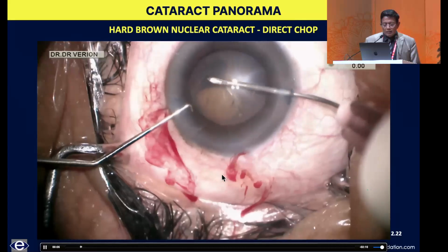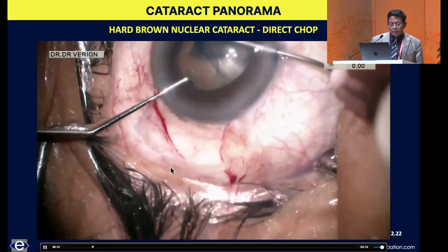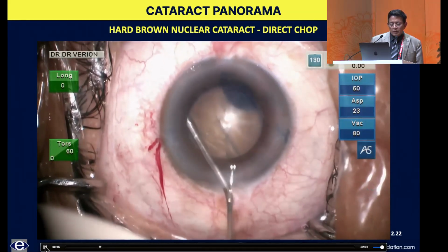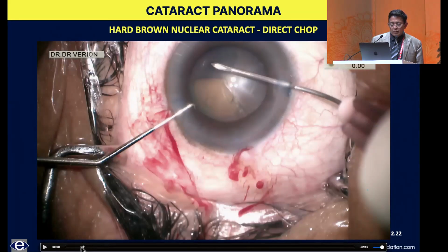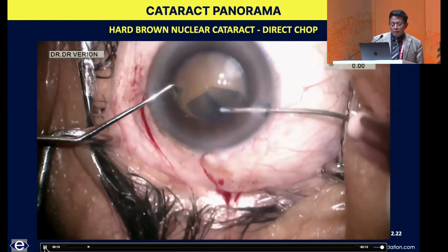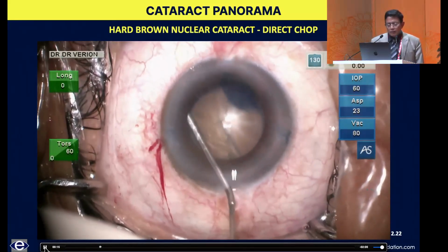Well, the dye is important because not only does it assure a nice visibility for the capsulotomy, but you'll have better visibility with your chopper, your phaco tip in terms of the capsular edge. And you're clearly making a very wide capsulotomy, which, if you're skilled enough to do that, will help.